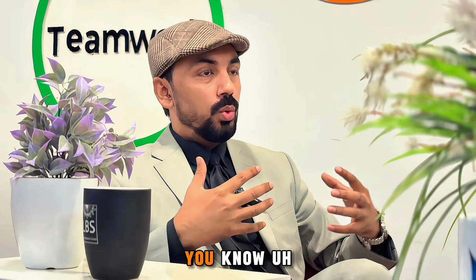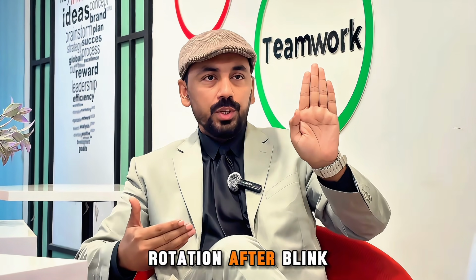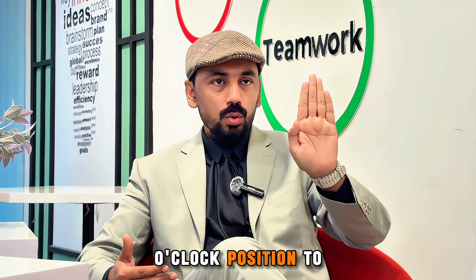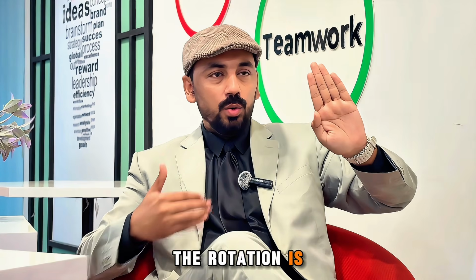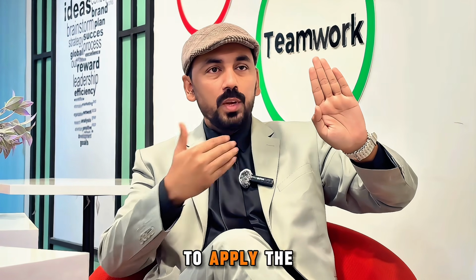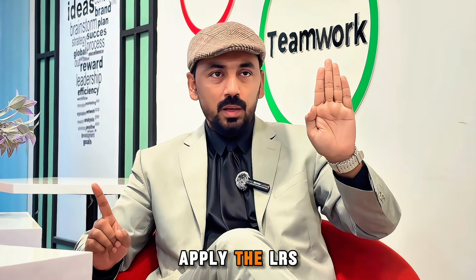So if we want to calculate the degrees of 1 clock hour, for example, if this is the 6 o'clock position, and the lens rotation after a blink is from the 6 o'clock position to the 7 o'clock position, and the lens is not coming back, the rotation is consistent, so we have to apply the LARS rule now. If the lens comes back, we will not apply the LARS rule.